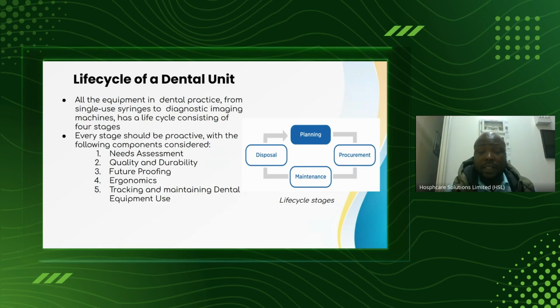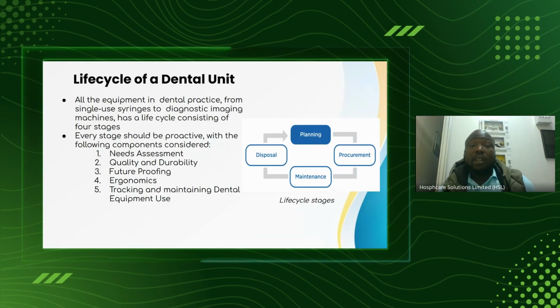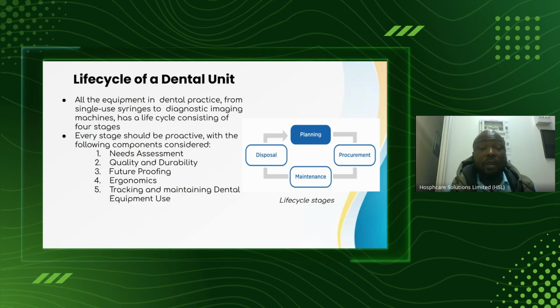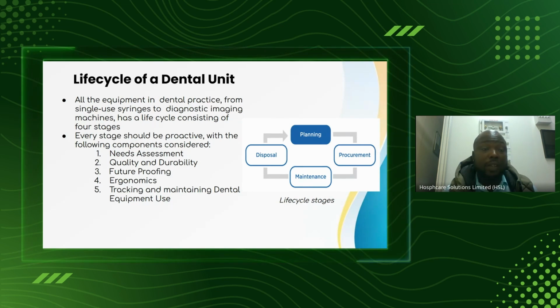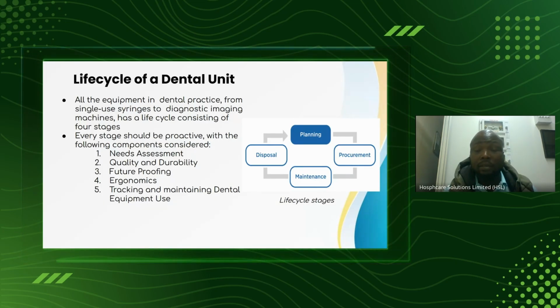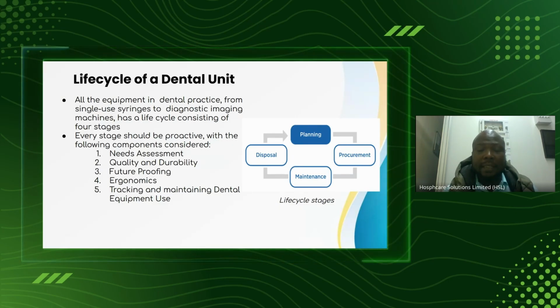As engineers, we are invited by a dental practitioner or a maxillofacial surgeon. They want to set up a dental setup. You are supposed to have a plan. In this plan, you should be able to define the flow of the effluent, the drainage system. You need to design it in a way that the drainage system has enough gradient. Remember, the effluent from the patient's mouth is very thick because it comprises blood, sputum, and so forth.